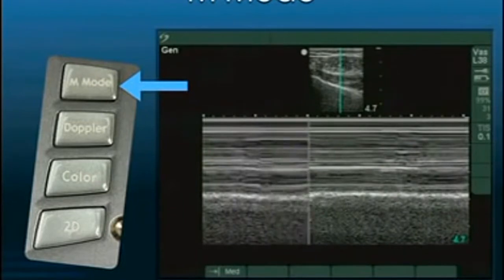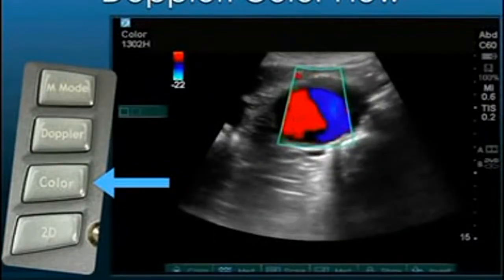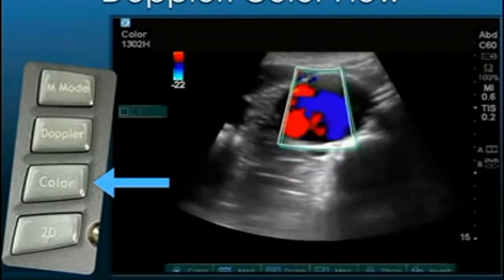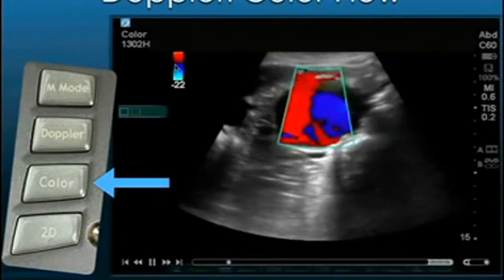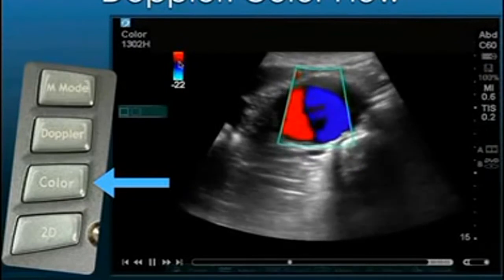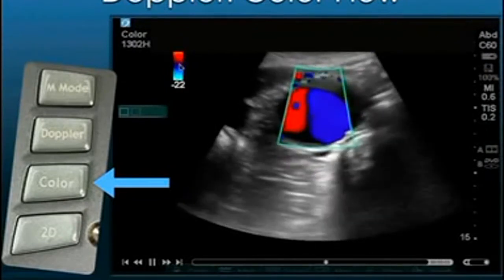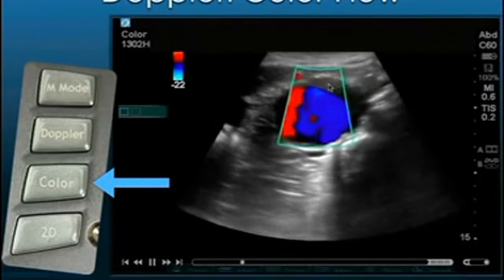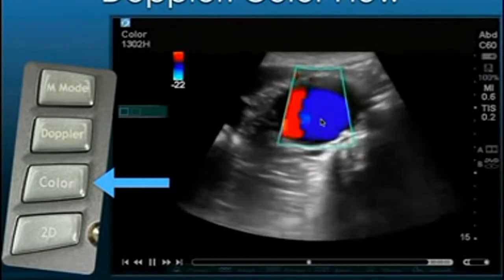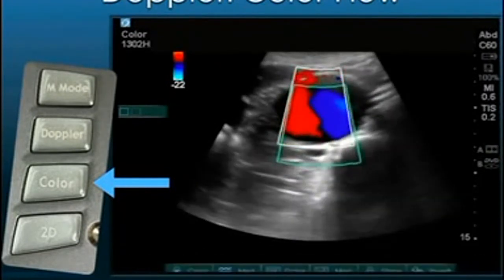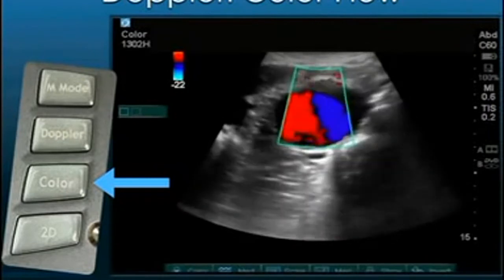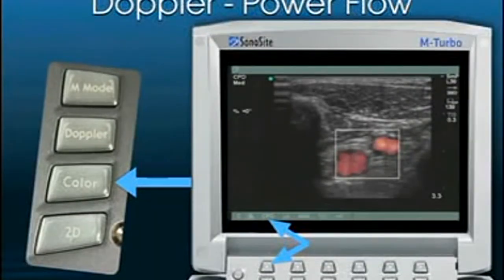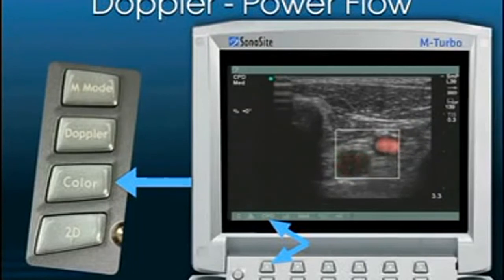Then there's color flow Doppler. Color flow Doppler is directional flow. Red is flow towards the transducer, and blue is flow away from the transducer. As we can see here in this aortic aneurysm, there is turbulent flow going back and forth. Another type of Doppler is called power flow Doppler or color power Doppler.